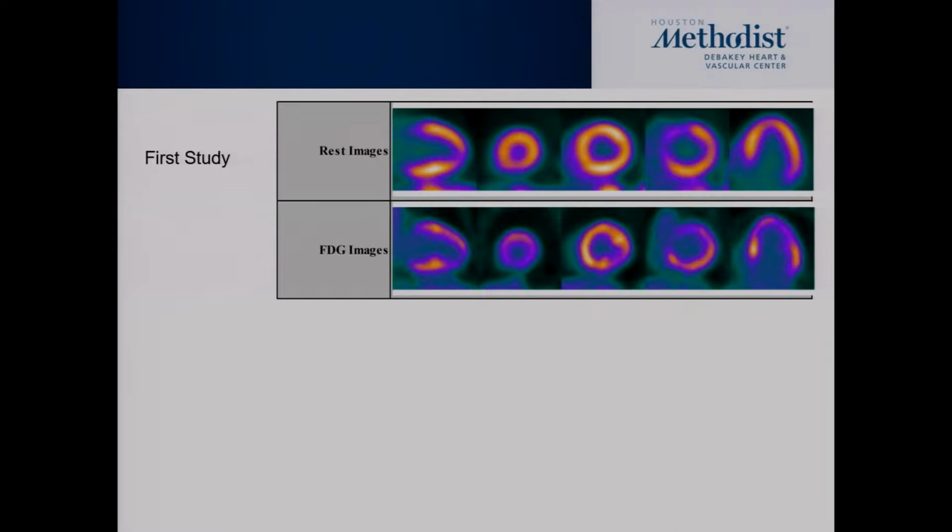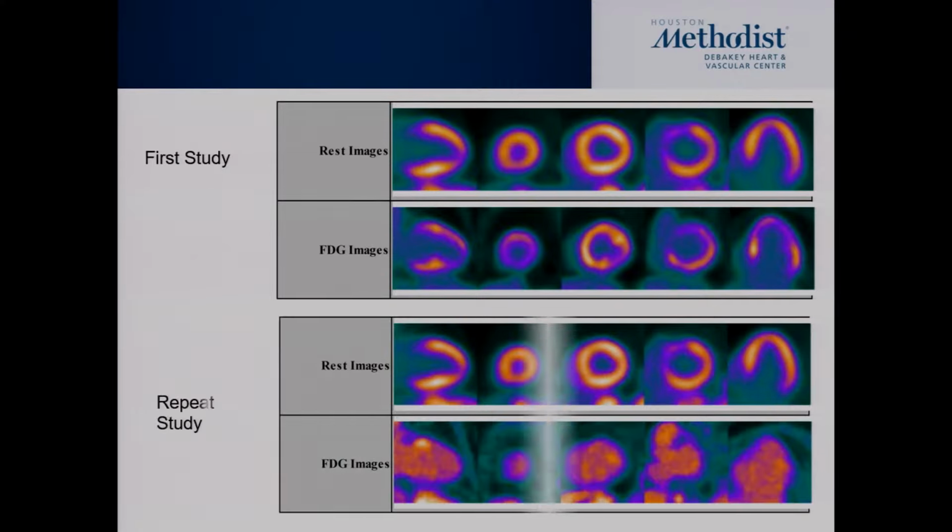So if a patient tells us that they didn't follow the instructions, we're not going to even start, and we'll just reschedule them. But this patient, we didn't believe it, so we said, why don't you follow the instructions for 48 hours? Whatever they did, they came back later, and now it's a normal study.